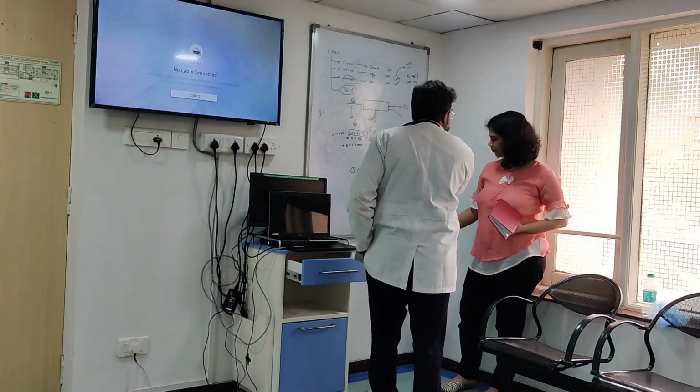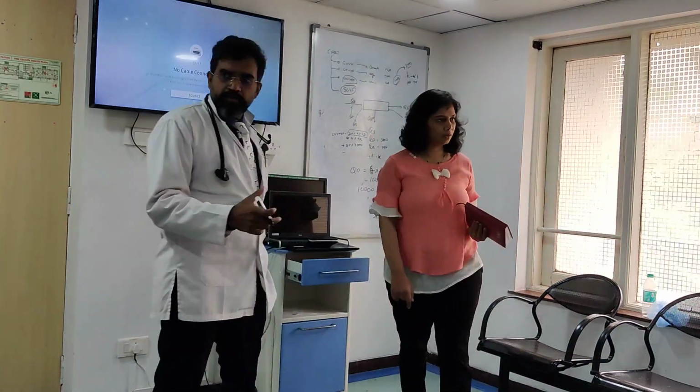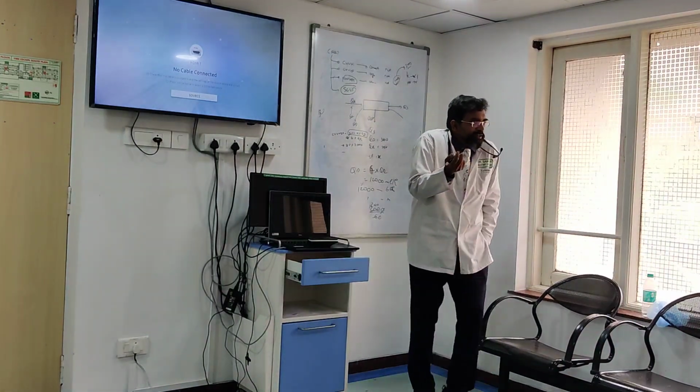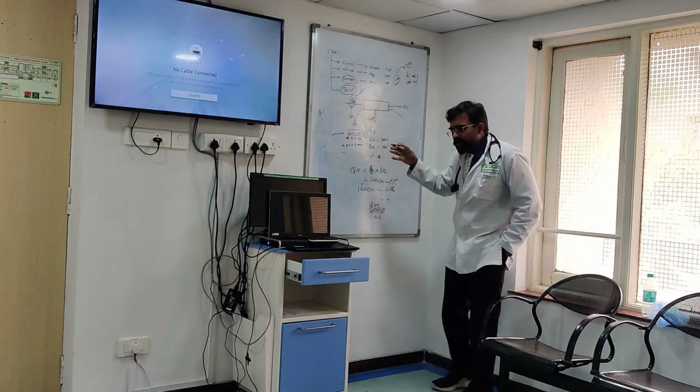So what is my blood pump flow? 200 ml per minute, understood? Not per kg; blood pump is ml per minute. This is the 33 one. What is my efficiency now?